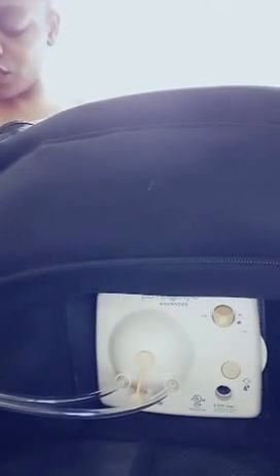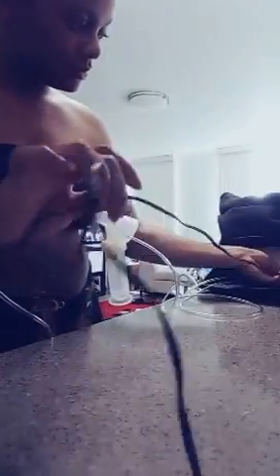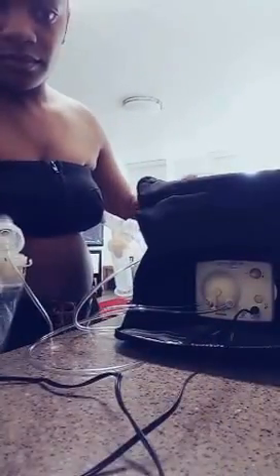So now we use the knob on the pump right here, and that is what determines your suction flow. Right now we're going to put it on the lowest flow, and for me, that doesn't really do anything. I can't really feel the suction at all. So I'm going to turn it up a notch. Oh, actually, sorry, classic mistake. I forgot to use the adapter. So you just simply plug the adapter into the wall, plug it into your pump. And now we're pumping.